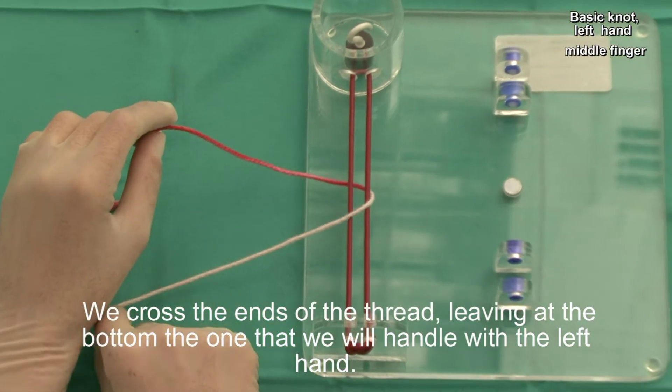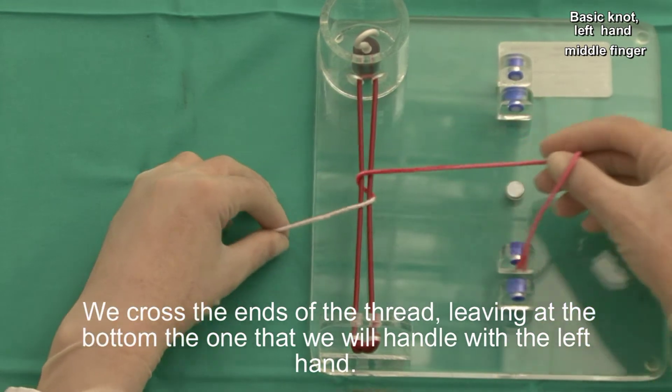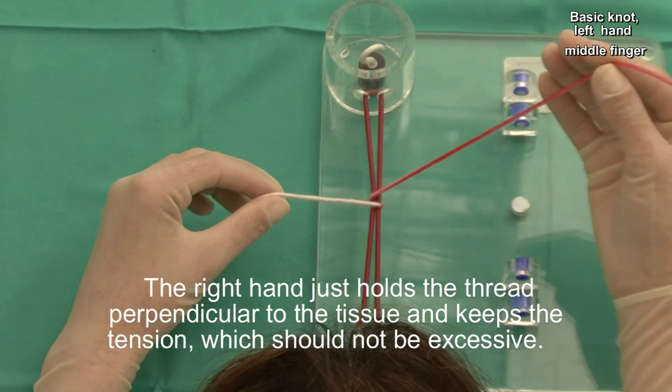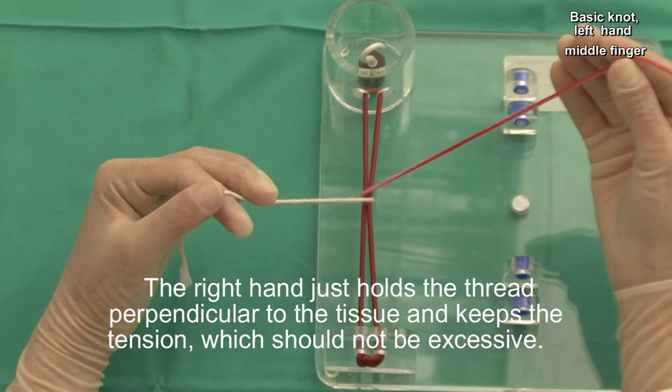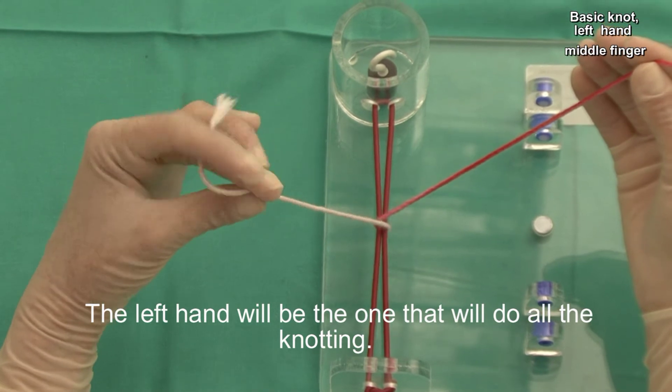We cross the ends of the thread, leaving at the bottom the one that we will handle with the left hand. The right hand just holds the thread perpendicular to the tissue and keeps the tension, which should not be excessive. The left hand will be the one that will do all the knotting.